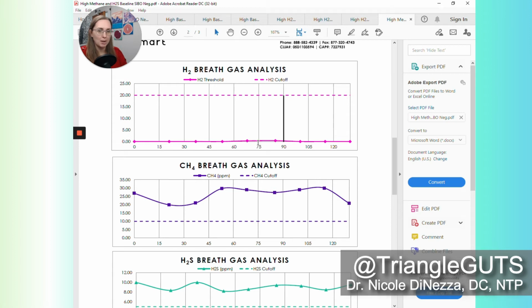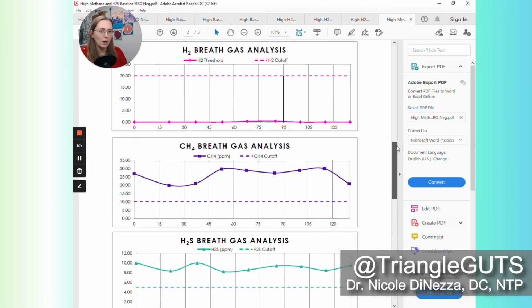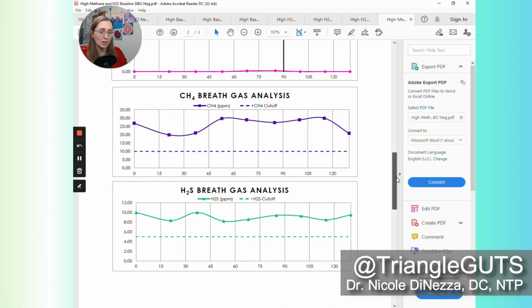This is what we're talking about when we're talking about a flatline. There's really hardly any hydrogen at all. And you can see one of the reasons why. So hydrogen, you'll notice the chemistry of it all. So H2 can get made, if you slap two of those bad boys on a carbon, it can get made into methane, and that's exactly what the methane producers are doing. And similarly, if you take one H2 and slap it on a sulfur, you can get hydrogen sulfide. And that's exactly what the H2S producers are doing. So keep that in mind, and that's why we were thinking for a while there that a flatline H2 breath test could be indicative of an overgrowth of one of the other two gases.